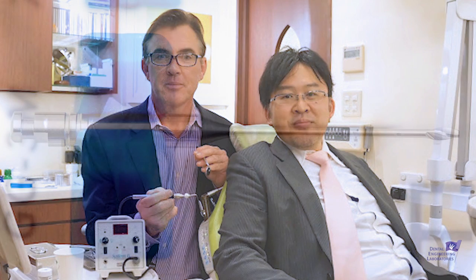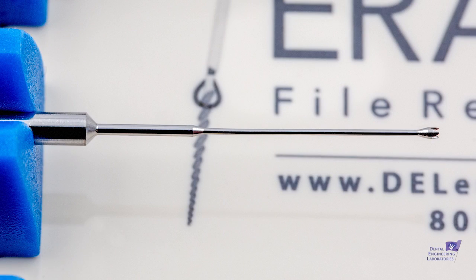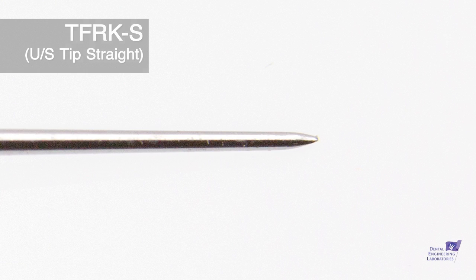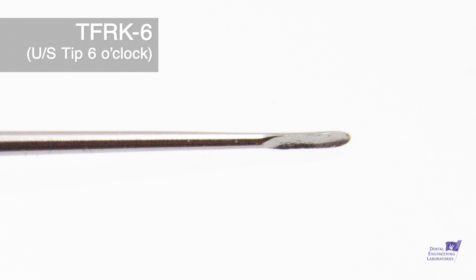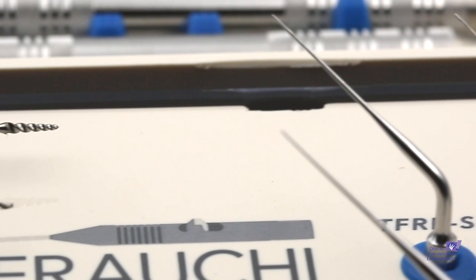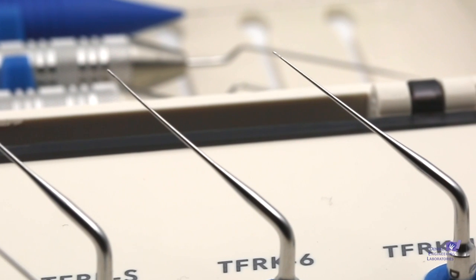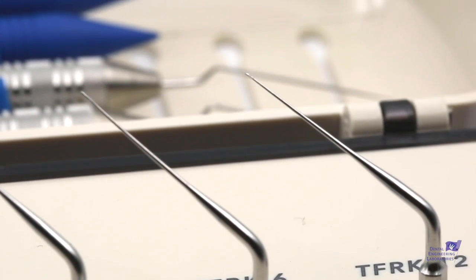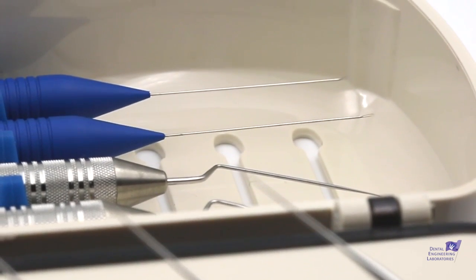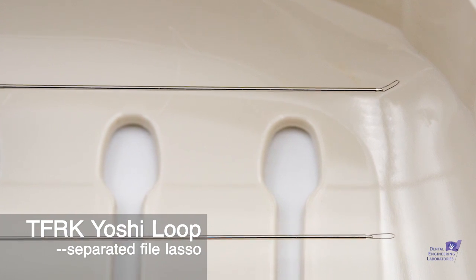The kit components include a modified number three Gates Glidden burr, a Trefine burr, a spear-tipped ultrasonic device, and two spoon-shaped ultrasonic devices to aid troughing. Additionally, there is a very cool device underneath the top plate: the Yoshi loop. The Yoshi loop is totally unique, patented in the United States and Japan, and it is one of the few ways to get these files out when they don't want to come out with just the ultrasonics.